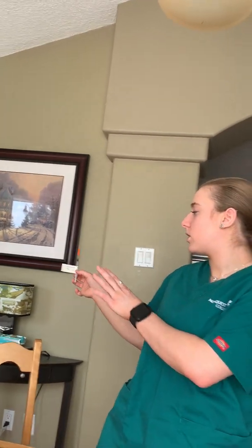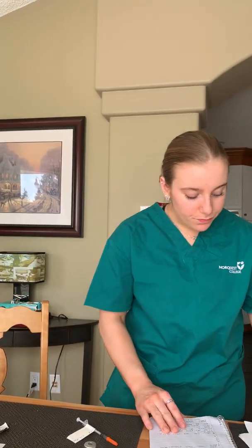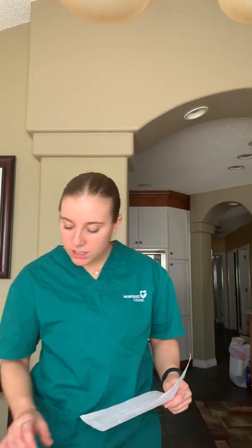We don't want to place it over because we won't be able to tell how much we're giving. If I had a buddy nurse here, I would then show my nurse to ensure that they will check it as well so that I have the right amount, and they would check that for me. After that, I will then do my second check and the 5 rights once again. So we are going to be doing right patient, which is Roger Stevenson, right medication, Humulin R, the right dose, which is 0.12 ml, right time, 8 a.m., and right route is subcutaneously.